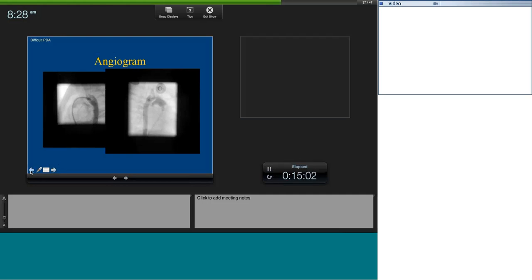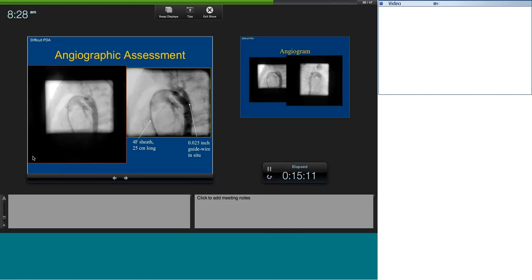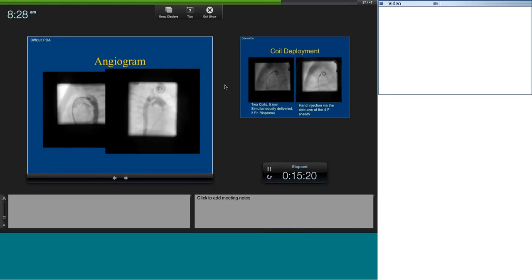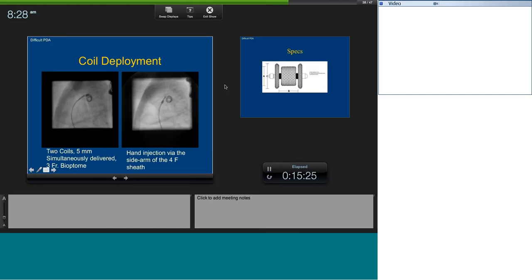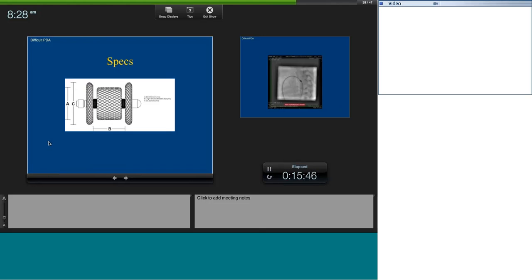You get pictures in two views with small volumes of contrast. Through the same delivery system, you can advance the coil mass — in this case two coils. It takes some confidence, but we've been able to close these ducts nicely. Today we prefer the ADO-2 additional size — it's easier and safer than coils, though more expensive. For patients with economic challenges we still use coils, but where possible we've moved to the ADO-2 additional size.